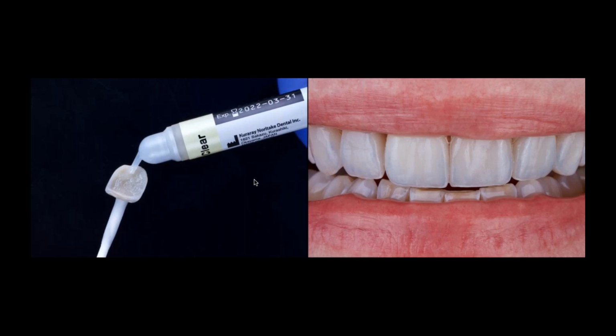It's very important at this moment to have worked with the patient through those two weeks of the best oral hygiene of her life through this process. Why? Because we want to make sure that we have no inflammation at all, so we can optimize the quality of our adhesive cementation protocols. I like to use the Panavia V5 resin cement system.